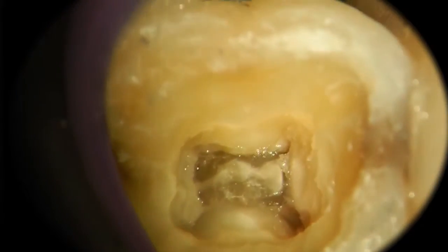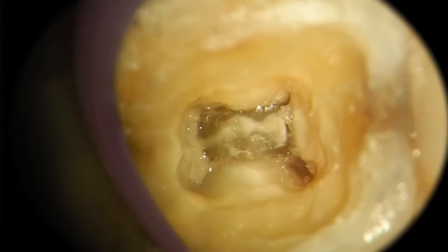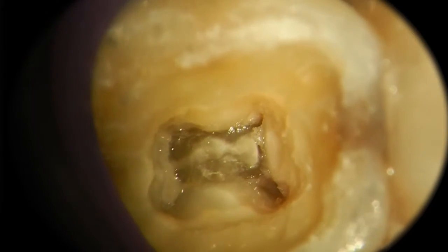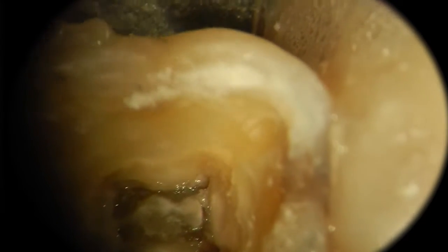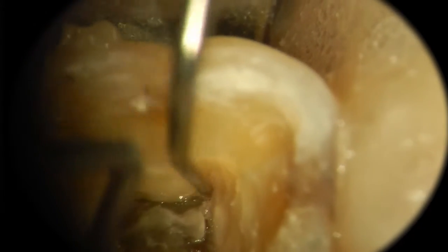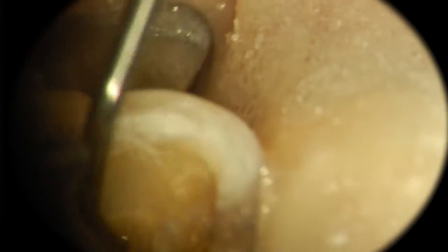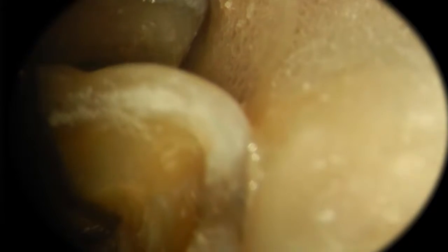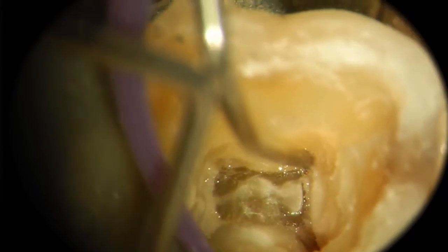Now look at how this thing starts to change. I'm going to adjust this again, because as you change, look at now the view we're starting to get of the chamber. And the layout, the anatomy. We can kind of start to see some more anatomy here. Boom. A stick like that is a very good sign that we have ourselves a canal right in there.